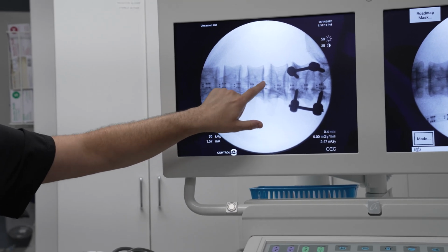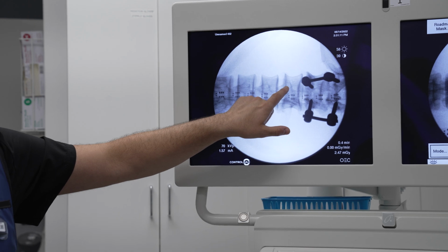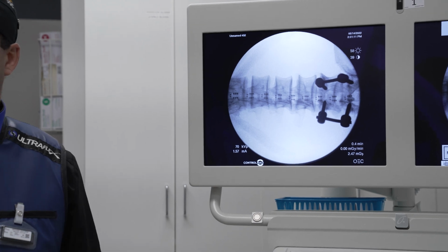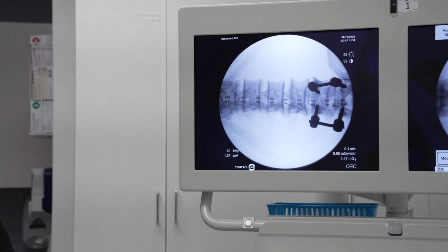If we want to do a facet joint injection, this is actually the same exact setup for a facet joint injection. Also same setup for a medial branch block, right? Medial branch is right on the eye of the Scotty dog. Facet joint injections are kind of out of favor these days. We don't really do those for facet joint pain. The only time I do those is if there's a cyst and we're trying to aspirate that cyst. And it only works about 10% of the time, but it'll save the patient a surgery.